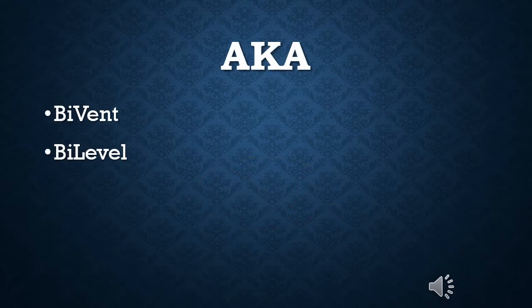Now, you may have heard APRV by a different name. Remember, APRV is a trademark name. So when the other ventilator companies caught wind of how awesome this mode of ventilation was, they all wanted to jump on board. But since they couldn't use the same name, they had to create their own. So you may have used APRV as either bi-vent or bi-level. They also had to add some slight tweaks in order to not be selling the exact same product, so you might have an option of using pressure support and or PEEP, whereas traditionally you couldn't use this in the original form of APRV. But for the most part, all the strategies are basically the same.